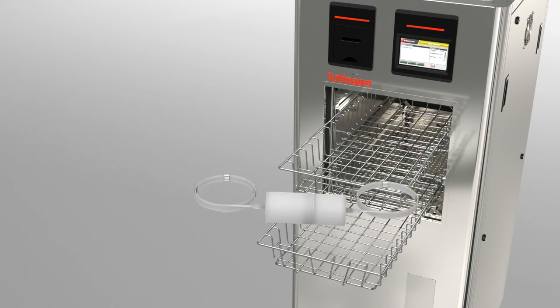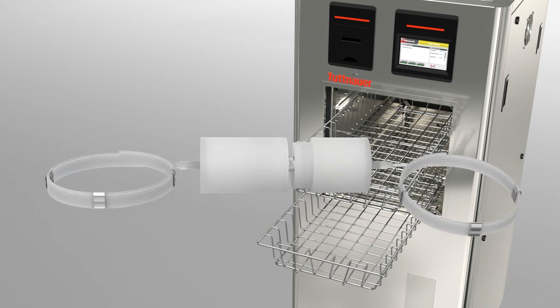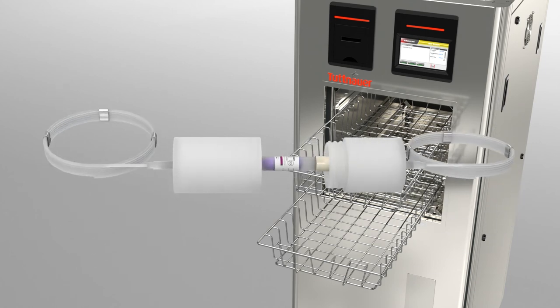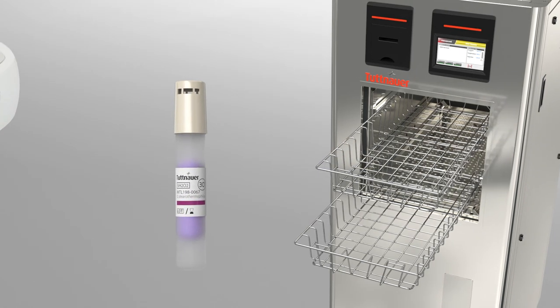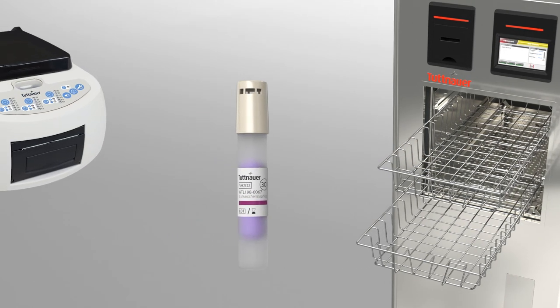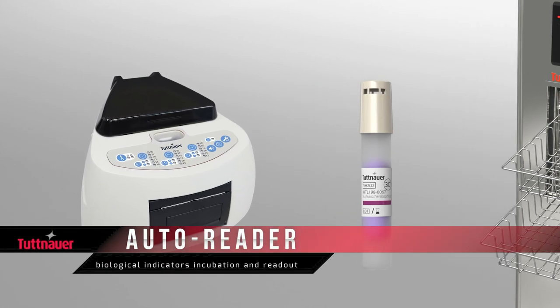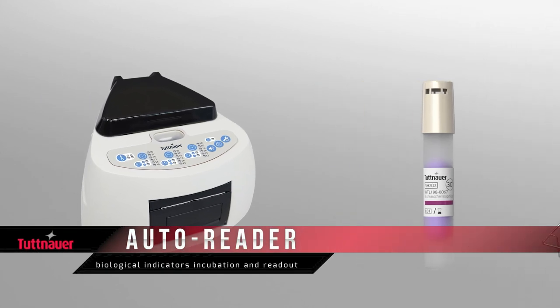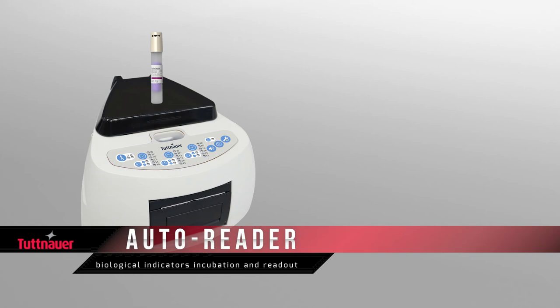The biological indicator is pulled out of the PCD and placed for incubation in the auto-reader. Our auto-reader allows quick, accurate, and reliable detection of positive and negative results.